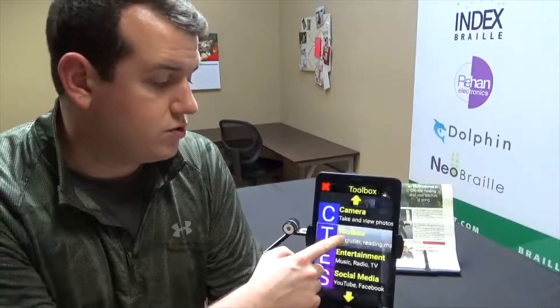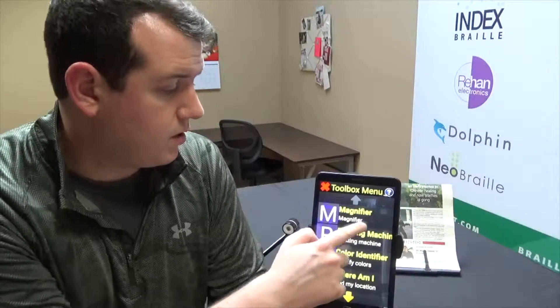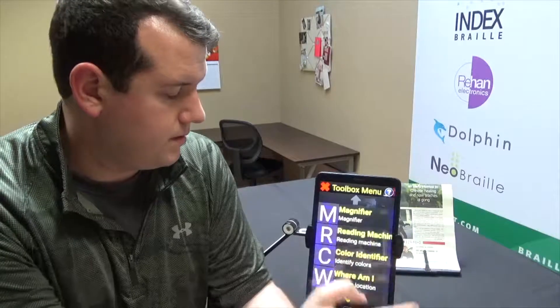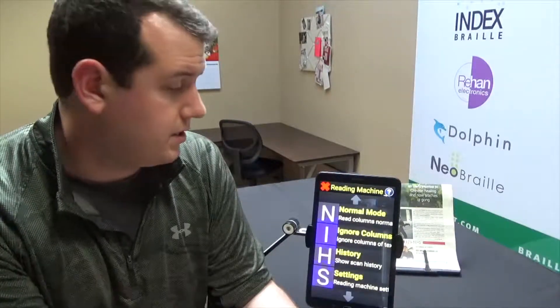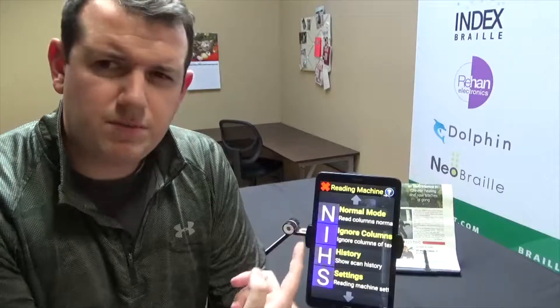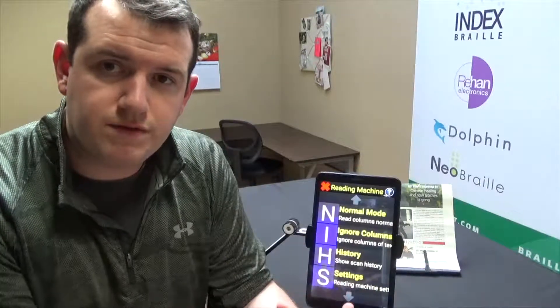On your Synaptic device, go to Toolbox — select Toolbox — and then go down to Reading Machine and open it up. Once inside, you can see a couple of different modes: you can look at your history of things that you've previously scanned in.